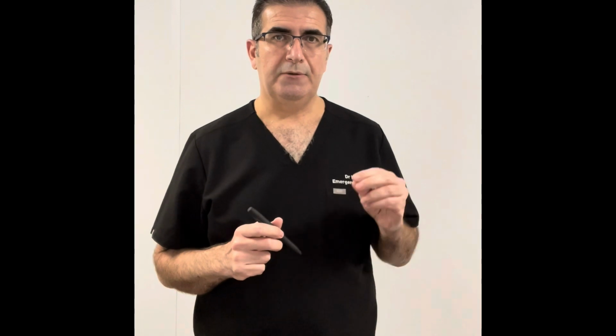And always, please do not forget to clean the ultrasound machine, because it will be used for another patient.